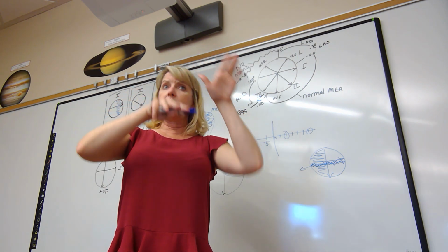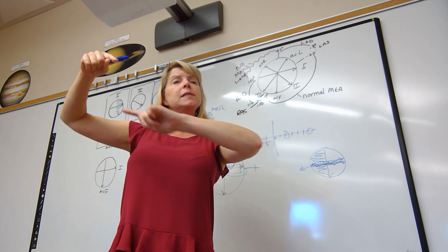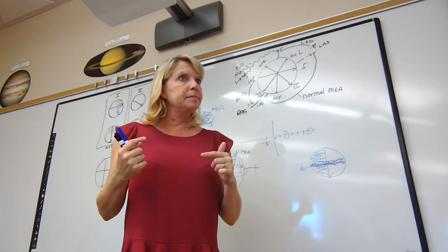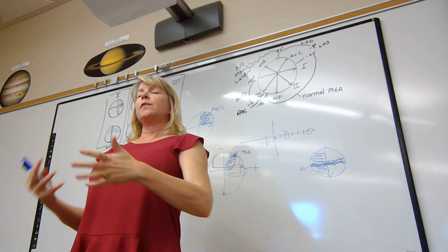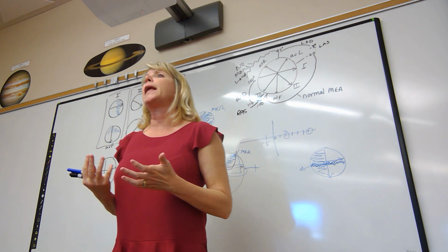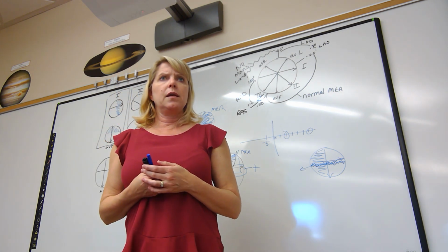That means on the EKG, I need to see your measurements and your algebraic sum. 1.5 points for showing your work, 0.5 point for showing me your overall MEA. What are the units for MEA?